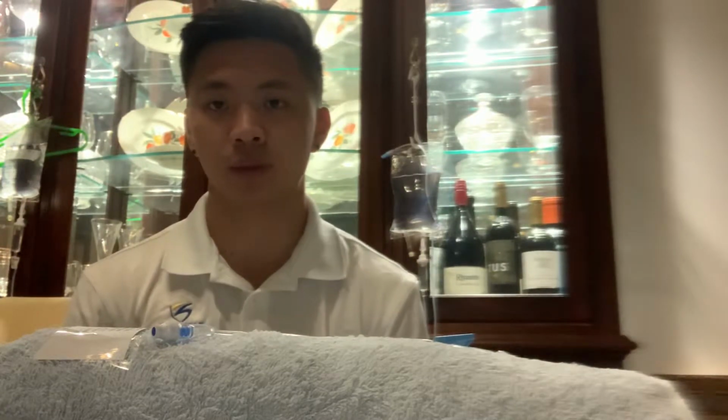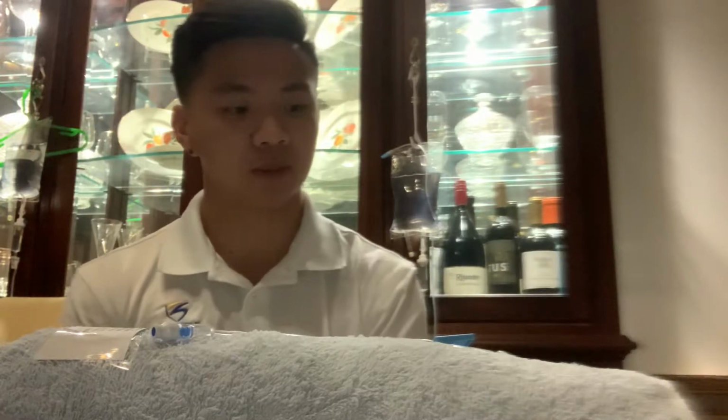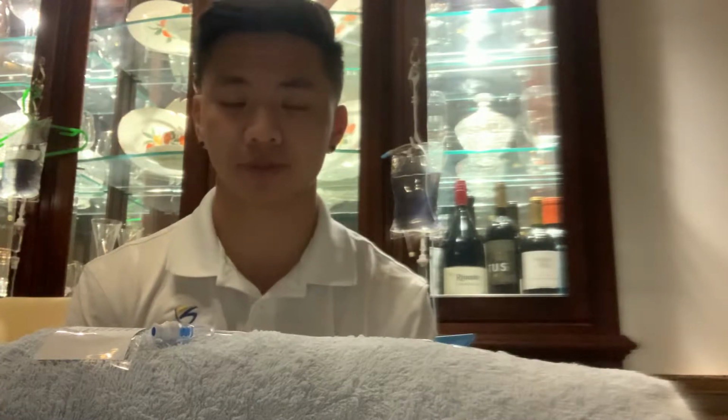So the first thing I'm going to do is verify the prescription or check the prescription with the healthcare provider and any allergies. And then I'm going to go ahead and introduce myself. Hello there, my name is Matt. I'll be your student nurse for today. Can I have your name and date of birth? So Anna Pawlowski, May 5th, 1957. Okay, just verify that wristband, verify that computer.